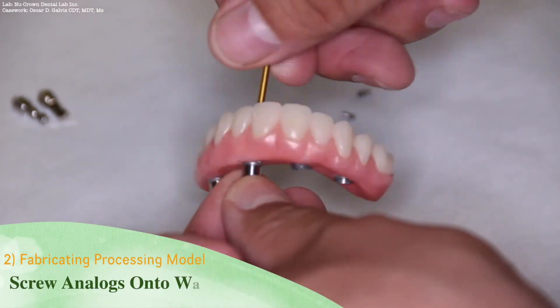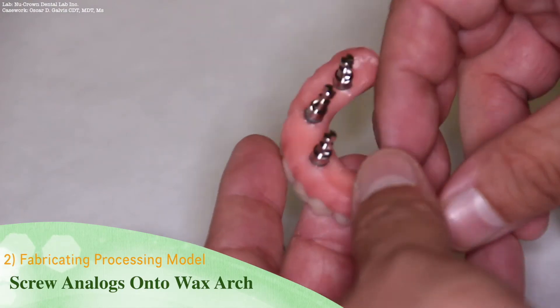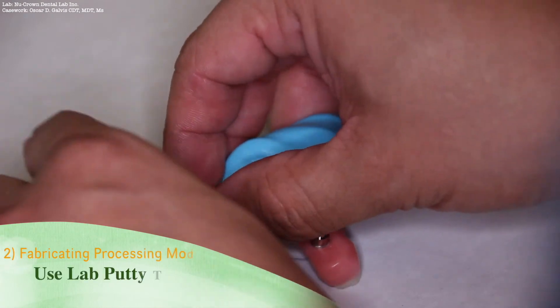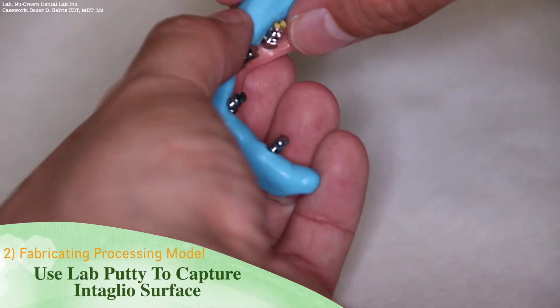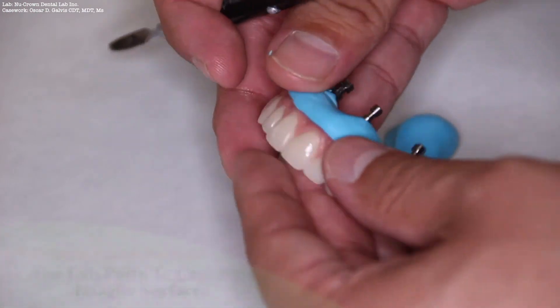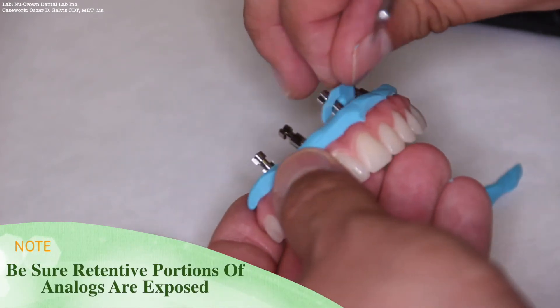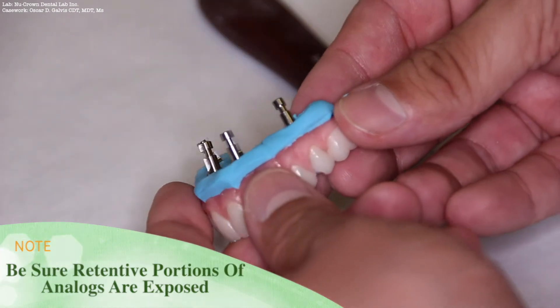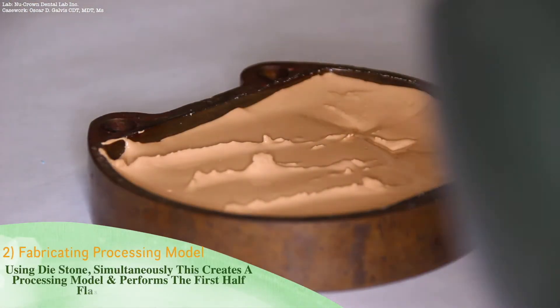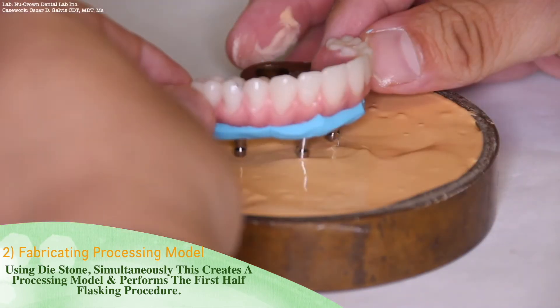When processing these types of cases, it is important not to process on the master cast. Here we will screw on analogs and create a processing model within the first half of the flask. To ensure a smooth intaglio on deflasking, you may use lab putty to capture these surfaces. When using lab putty, be sure the retentive portions of the analogs are still exposed. When performing the first half of the flasking, use dye stone. This will simultaneously create a processing model and perform as the first half flasking procedure.